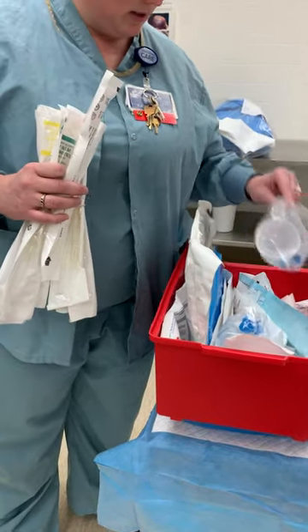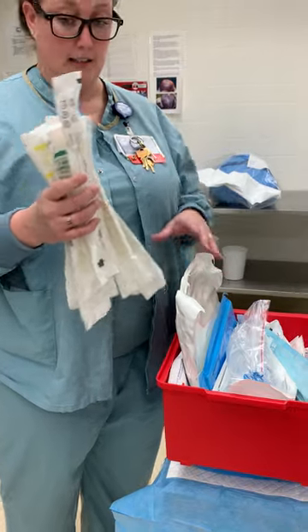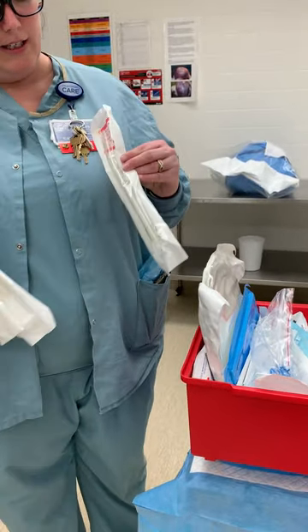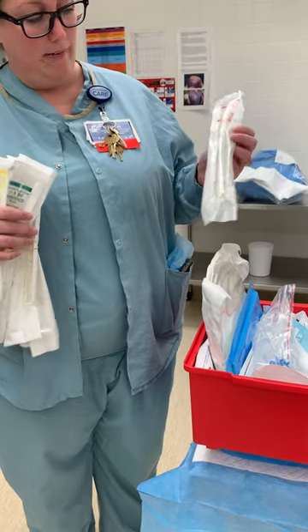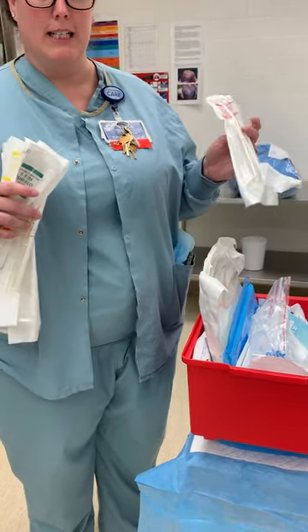And this curette — what do we do with it? Do we drop it on the table? Yes, this will also be opened sterilely and put on the table for your tech to hook to your suction tubing. And this is actually what will suck the contents out.